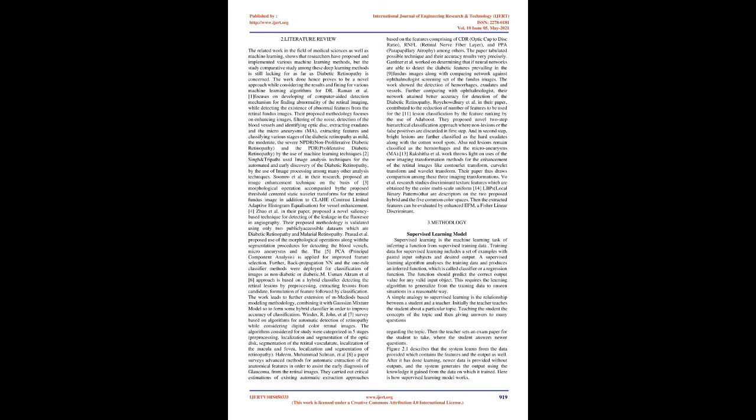However, the high cost of big labeled datasets, as well as inconsistency between different doctors, impede the performance of these methods. In this paper, we propose an automatic deep learning-based method for stage detection of diabetic retinopathy by single photography of the human fundus. Additionally, we propose the multistage approach to transfer learning, which makes use of similar datasets with different labeling. The presented method can be used as a screening method for early detection of diabetic retinopathy with sensitivity.